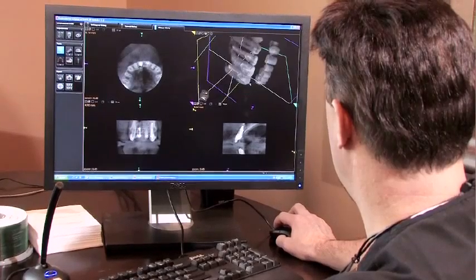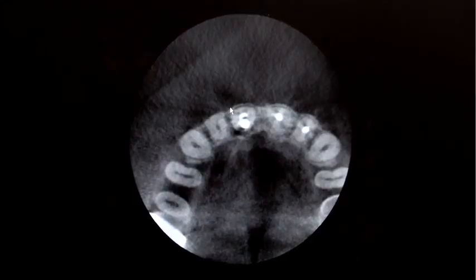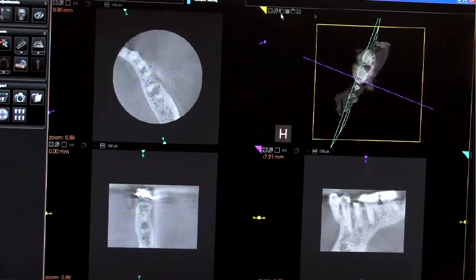One of the principal causes of root canal failures is missed canal space. In a two-dimensional x-ray, because of the superimposition of canals, you can't always see if there was canal space that was missed. But if you're looking at a cone beam image of that tooth, you can look at it in 3 dimensions so that if there is a fractured instrument or there is particular problem with a missed canal, we can actually look inside the tooth and see which canal was missed or which canal has that fractured instrument. So not only does it make it so that you can diagnose better, but you can actually increase the likelihood that treatment will be successful.